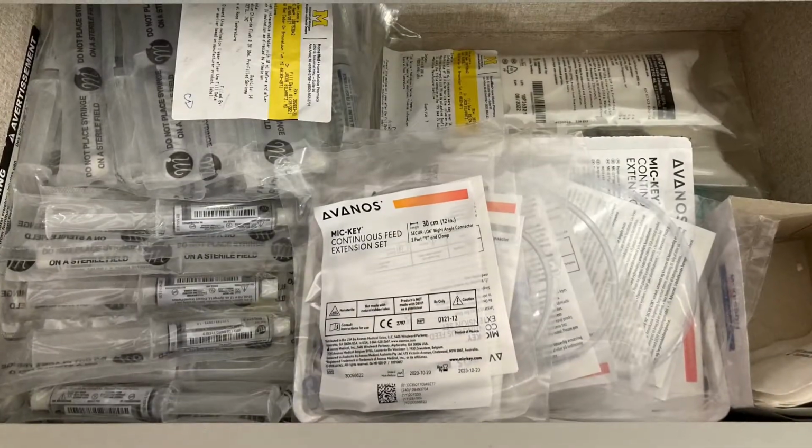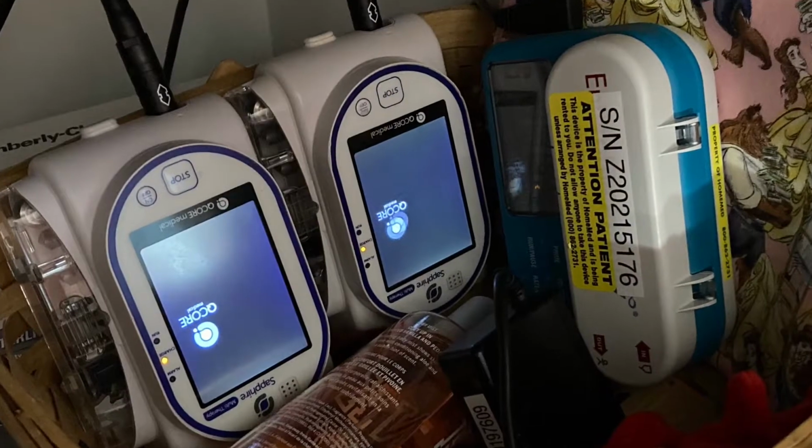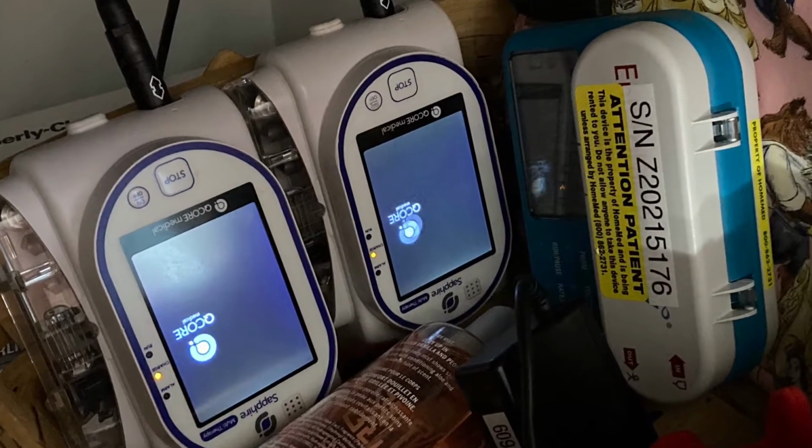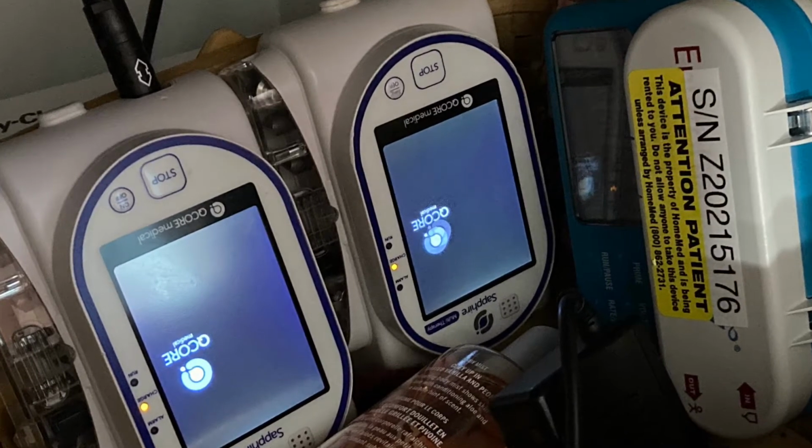From the second drawer, grab 1 lipids bag. Her lipids are called SMOF lipids. She has 2 sets of pumps that we alternate every other day. Remove the chargers from the new ones and put the old ones back on so they can charge for the next day.